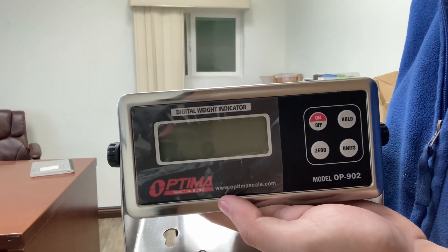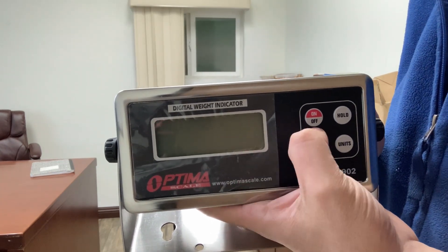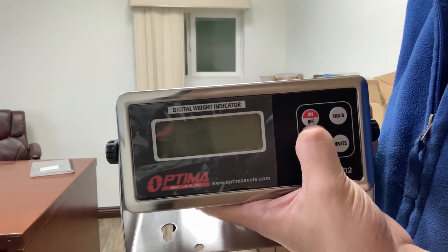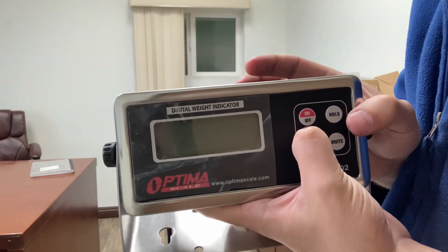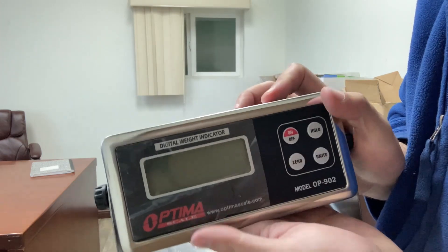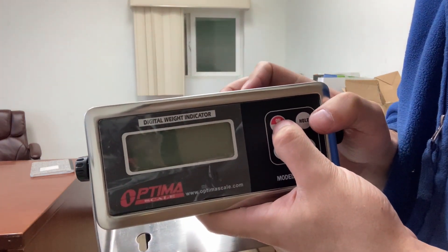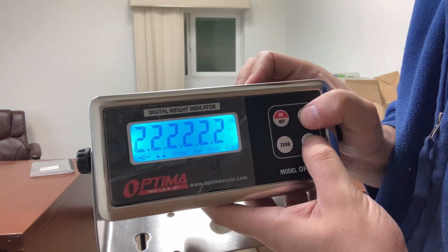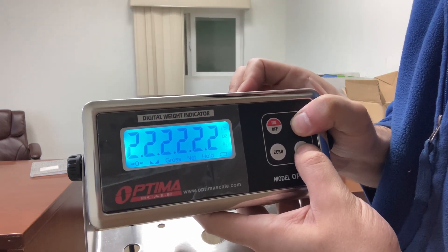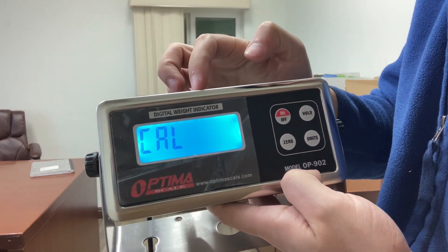Now we're trying to get into calibration settings. Make sure the indicator is off and make sure the battery is inside. This is the complicated part: when it turns on, we're going to be pressing and holding the hold and units button at the same time. While it's going in countdown mode, that's when you get into calibration. You turn it on, you'll see the countdown, press and hold the hold and units button, and it should say Cal.